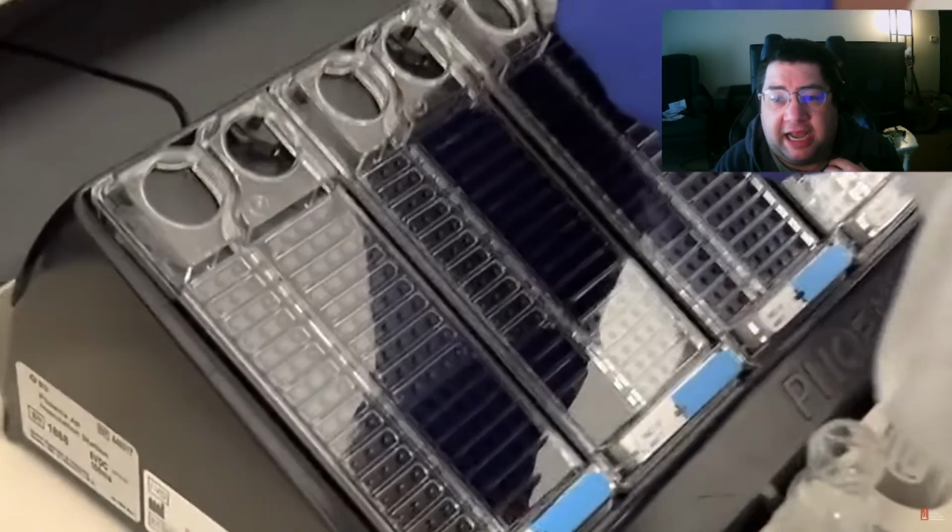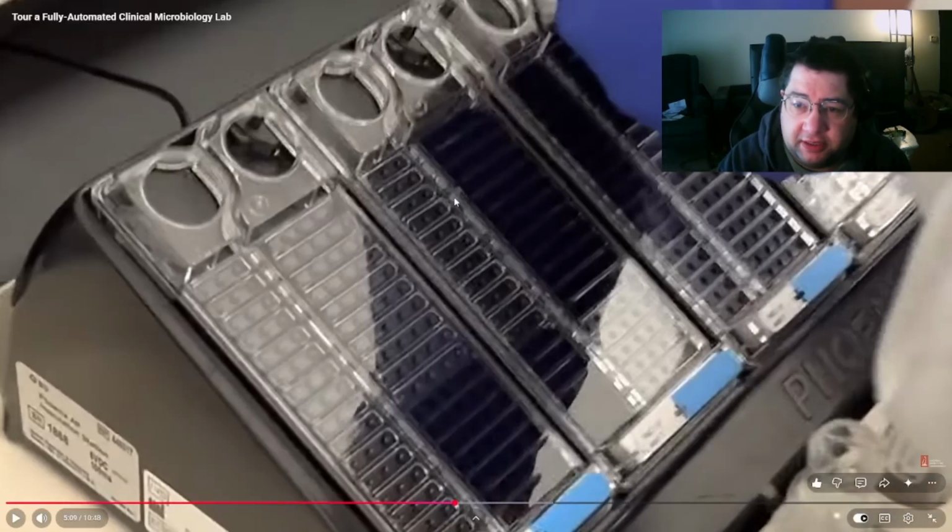I haven't heard a ton of good things about the Phoenix. It's a pretty big instrument, and you need a lot of space in order to use it, but I think it has a pretty decent capacity in terms of how many things you can set up. So each of these cartridges is a different patient. So he's working about 4 patients at a time right there.